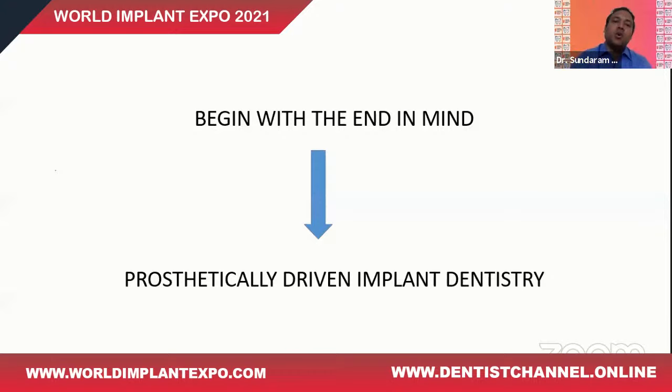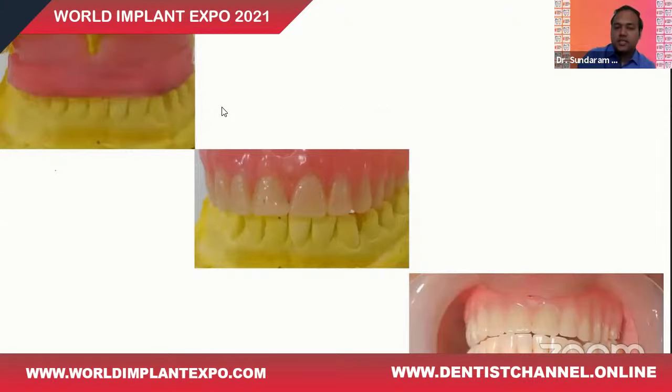So that is why you always begin with the end in mind. Like my mentor, Dr. Shankara, has rightly said, begin with the end in mind. And this is what is technically named prosthetically driven implant dentistry. So what do we do for that? When any such edentulous case comes, I would quickly prepare a wax bite and then get a provisional denture done. Once this provisional denture is done, I insert it in the patient's mouth to see how the future process is going to be.